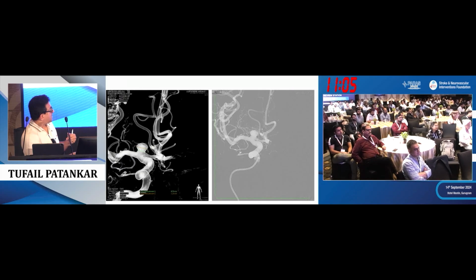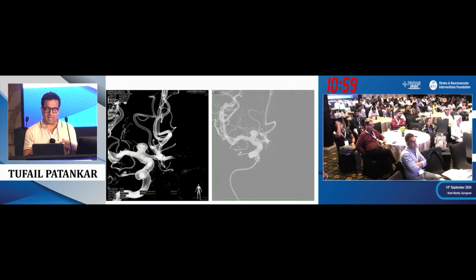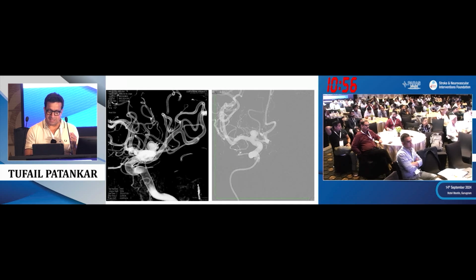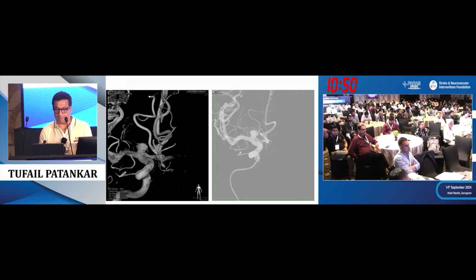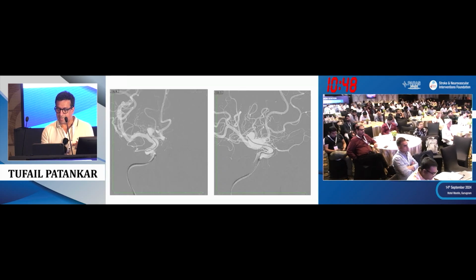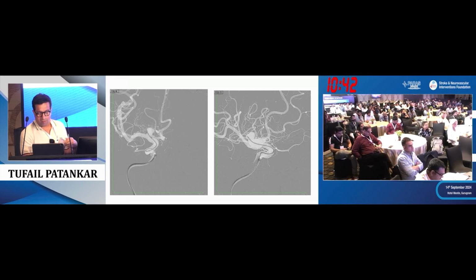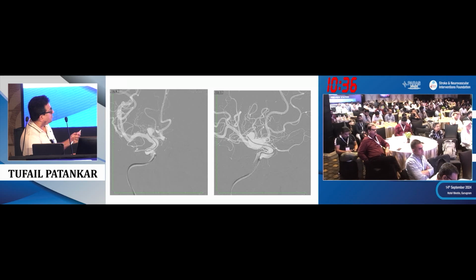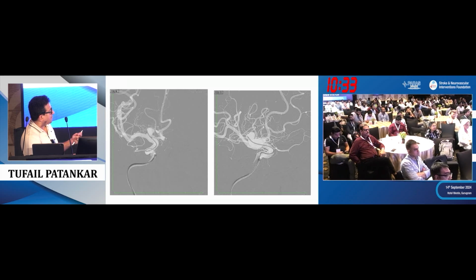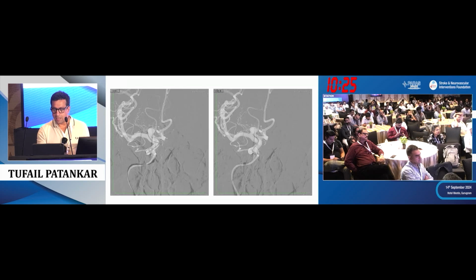When you look at aneurysms like these in a distal ICA, like all the cases, you can get into a tricky problem because of the axis, and the catheter can jump. Height is not a problem in contour, so that's one benefit of contour when you're accessing, because here you can see again when you catheterize, you're always going to end into the wall eccentrically. If you're going to have a web, it can be very difficult. You can see you got a nipple, you can't push. If you can't push, you'll have to unsheath and you'll end up coming out. Instead, here you know that you are safe enough, and then you can take the wire out.